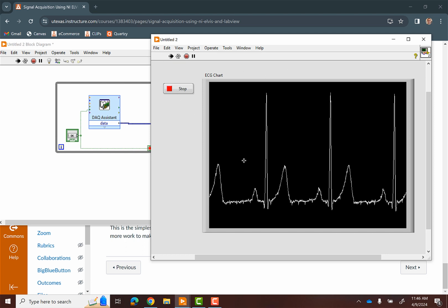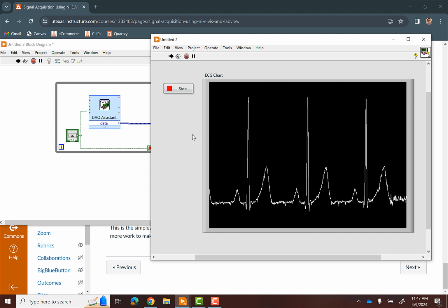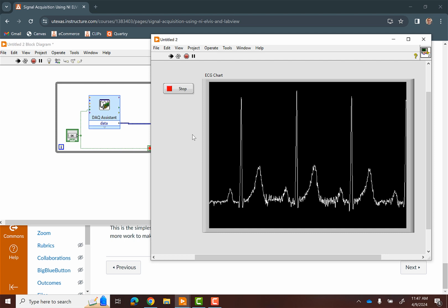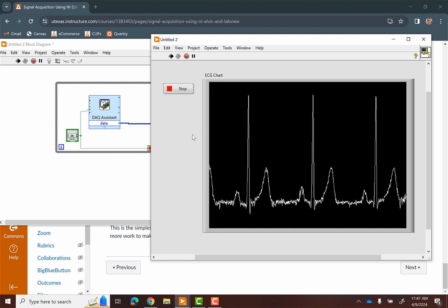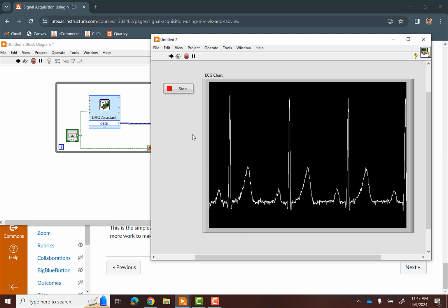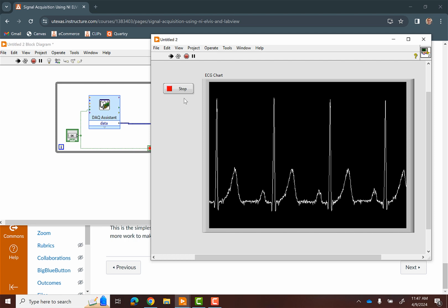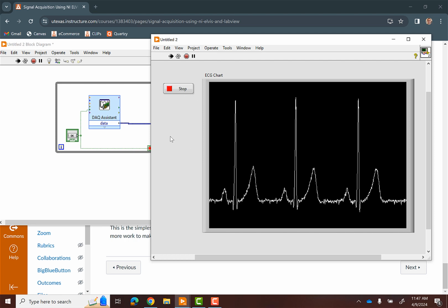But I give you guys freedom to mess with this and get a nice looking chart. Because that's our goal, is we want an instrumentation device that not only collects your data, but displays it as well. And so that's what LabVIEW is for. LabVIEW is a good tool that can be used to display any types of data. But for our purposes, it works nice as an ECG display.